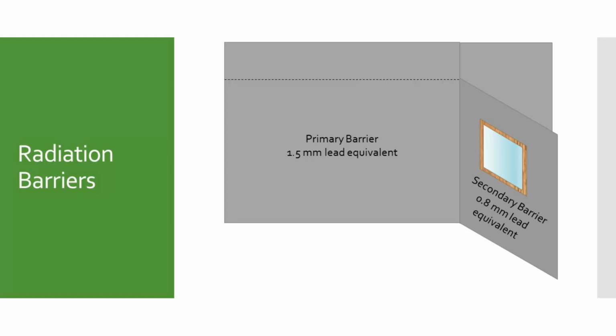The window in this wall that allows us to monitor our patients during the exposure is also required to provide the same level of protection as it is an extension of the secondary barrier. Leaded glass is able to provide this level of protection but requires special care.